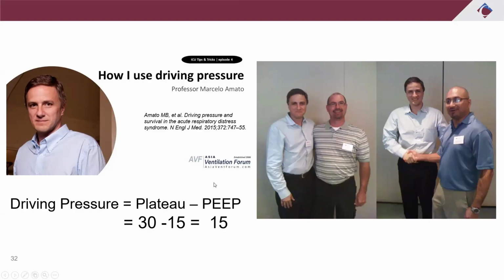Now, one of the highlights in my career, and hopefully my friend Angel, I don't know if he's on or not, but he and I got to go down to a conference at Loma Linda and actually meet Dr. Amato in person. After the conference, we got to go to the pig lab and we did recruitment maneuvers with Dr. Amato. I remember when we had to rotate stations, we went to the other lab where there was another pig on a vent. Sorry, I've got to think for a minute. What's the other PAV? We were supposed to do proportional assist PAV training on the pig, but Angel and I were trying to talk the guy into letting us use bilevel, but he wouldn't let us do it. So we wanted to set up APRV on the pig to see how they'd respond to it.